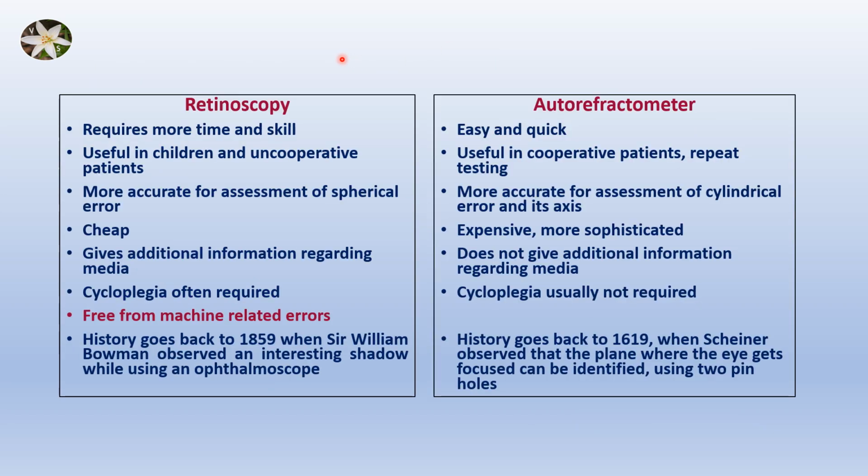The quantitative assessment of refractive error with autorefractometer is easy and quick, and with retinoscopy it requires more time and skill. Both the procedures have their value and place. Retinoscopy is useful in children and uncooperative patients.